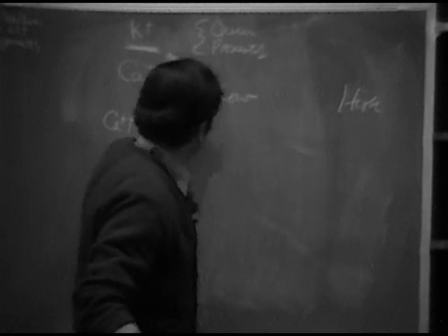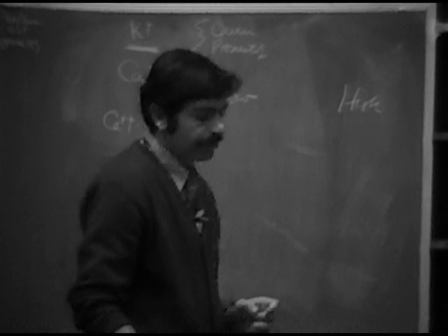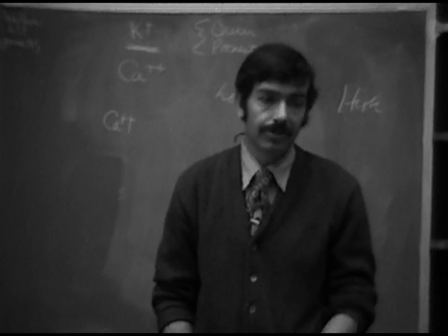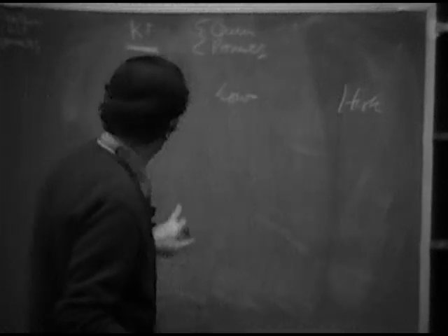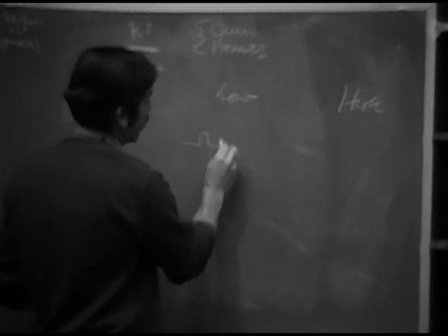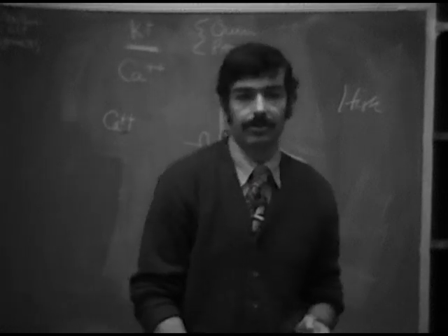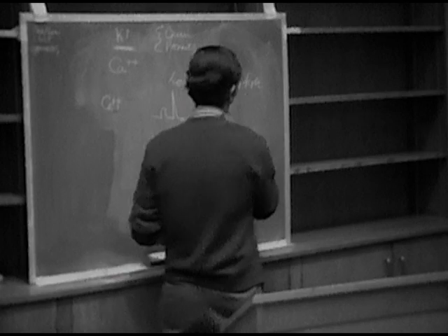These drugs, I should add at this point, and electrolytes generally produce disturbances of repolarization, which means they affect the QT interval and the ST segment and the T wave. So with hypocalcemia, you get QT prolongation. Looks like this. With hypercalcemia, you get just the opposite: you get shortening of the QT interval.